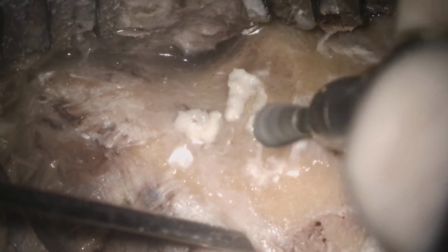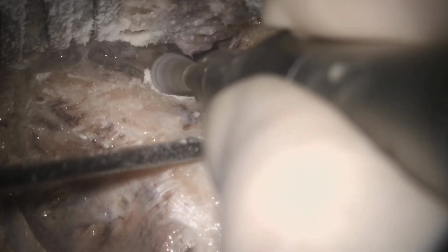Okay, so let's start. First we will demarcate the line of drilling. This is the superior part, the tegmen area. This is the linea temporalis. So the first cut will be along the linea temporalis. Next, the second cut will be the posterior canal wall, just posterior to the spine of Henle.